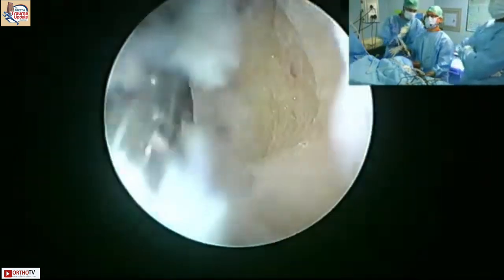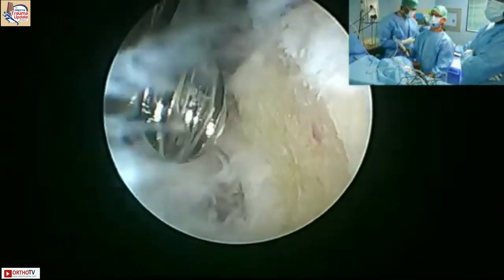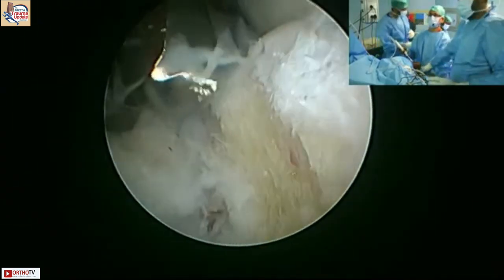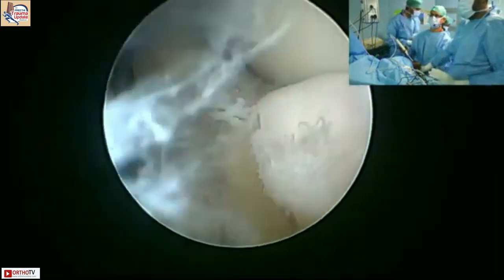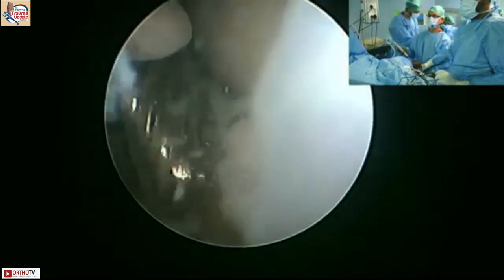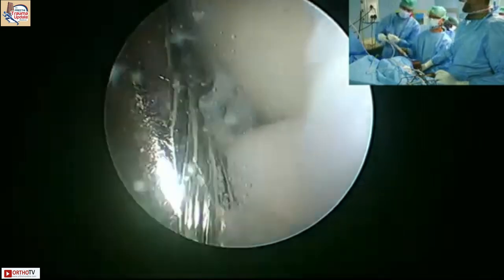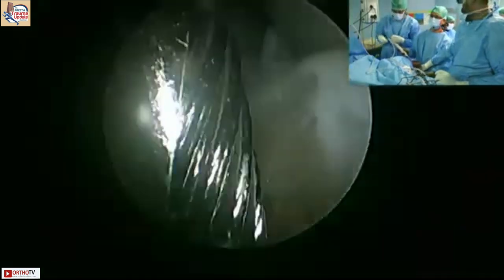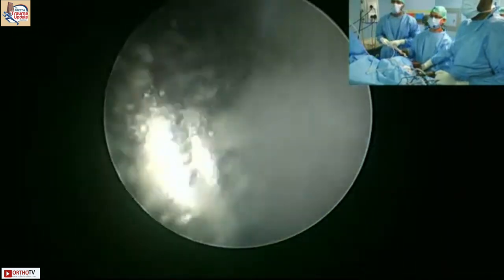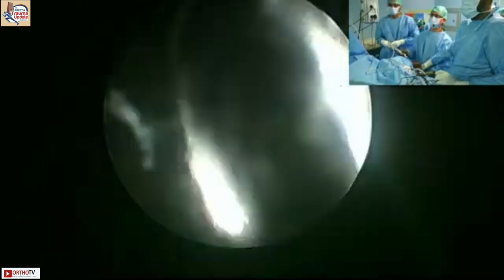You have a ball tip? Yeah, give me a ball tip if you can. So this is how much is left. Yeah, but just bendy. That's it, thank you. So you get ball tip burrs as well. Okay. Well, the problem is taking it out, putting it in. Give me a second. So the burr is making a noise, which means I'm coming to good bone.